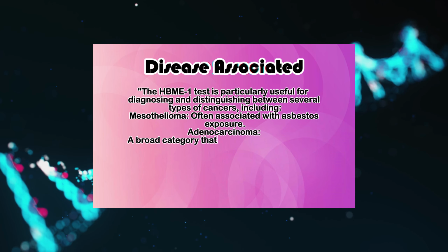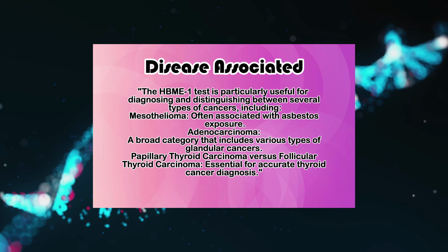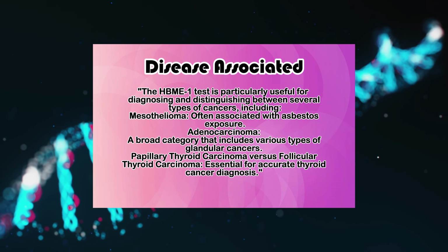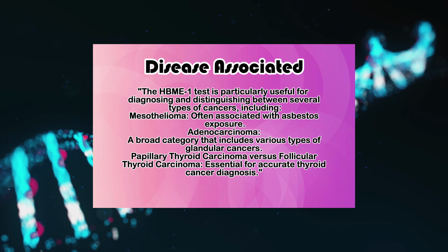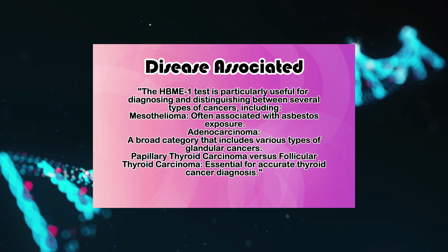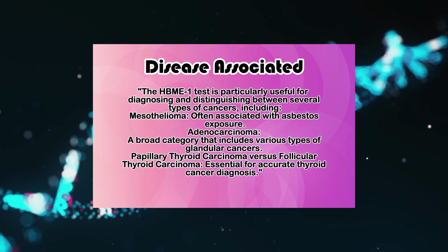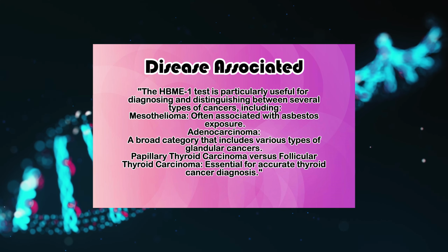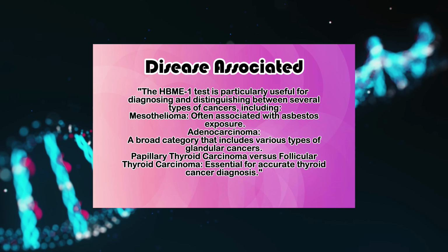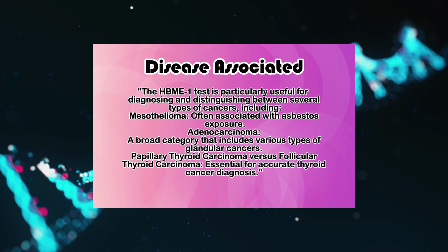Disease associated. The HBME-1 test is particularly useful for diagnosing and distinguishing between several types of cancers, including mesothelioma, often associated with asbestos exposure; adenocarcinoma, a broad category that includes various types of glandular cancers; papillary thyroid carcinoma versus follicular thyroid carcinoma, essential for accurate thyroid cancer diagnosis.